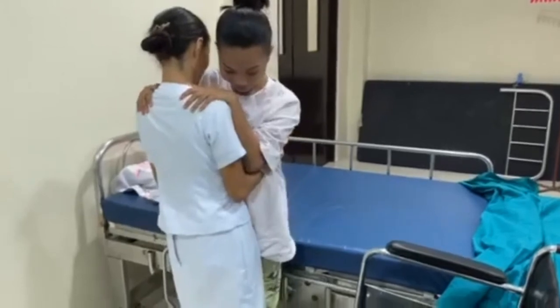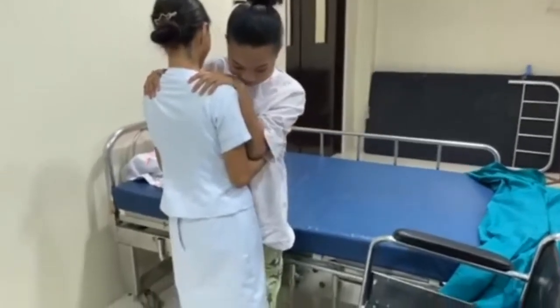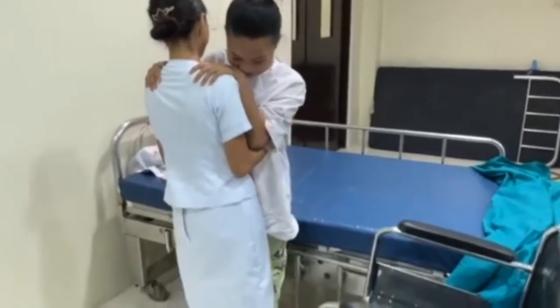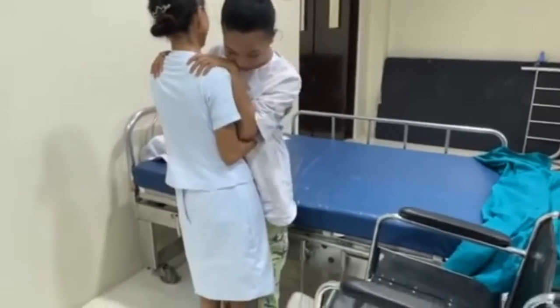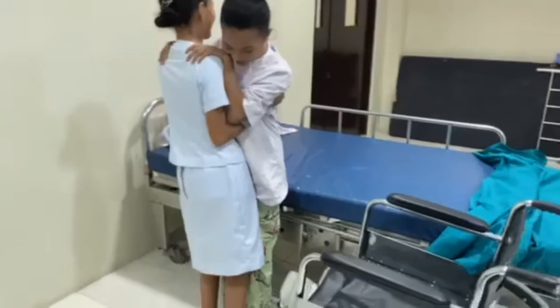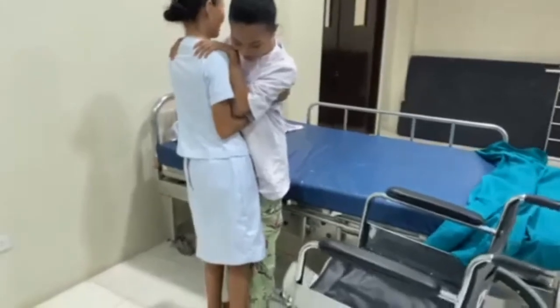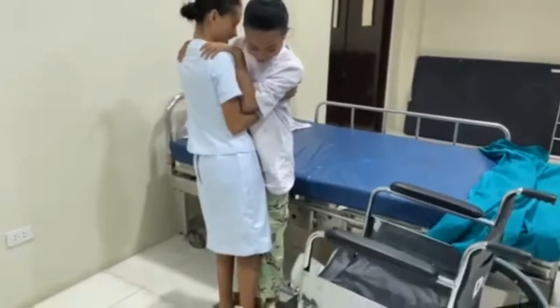On the count of 3 or verbal instructions of ready, steady, stand, and on the count of 3 or the word stand, ask the client to push down against the mattress or side of the bed. Together, pivot on your foot farthest from the chair or take a few steps toward the wheelchair.